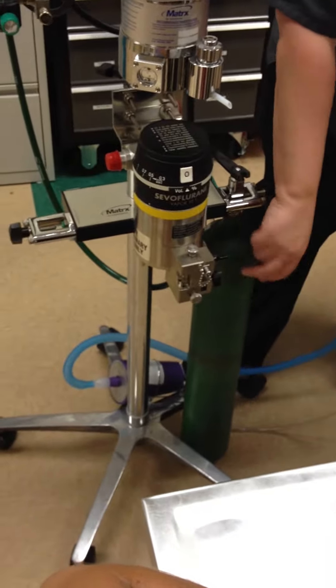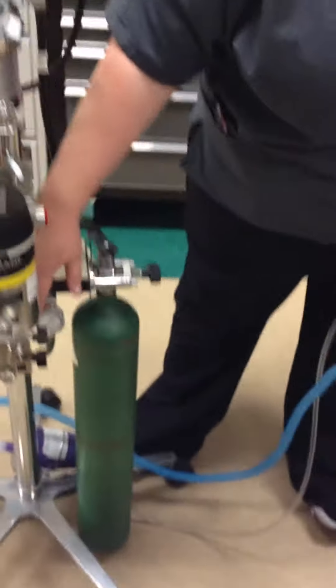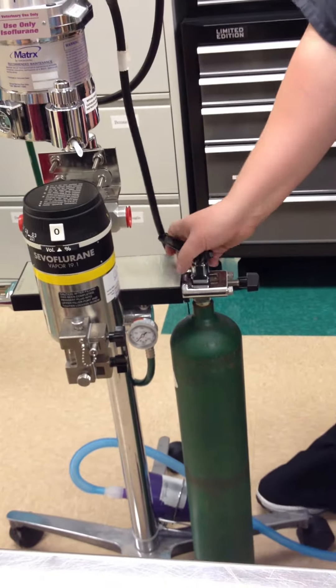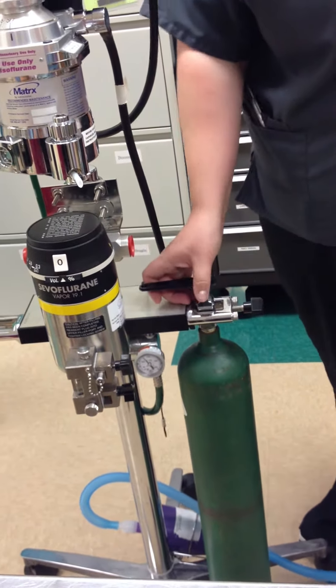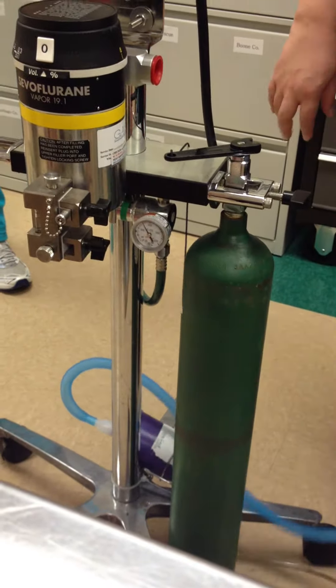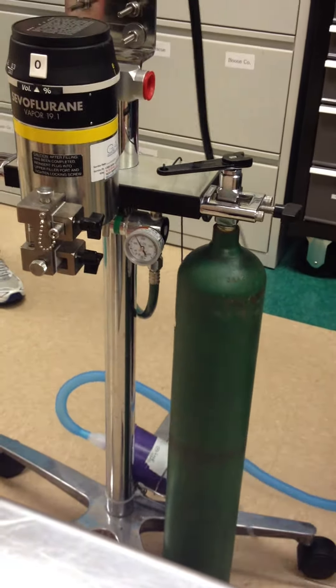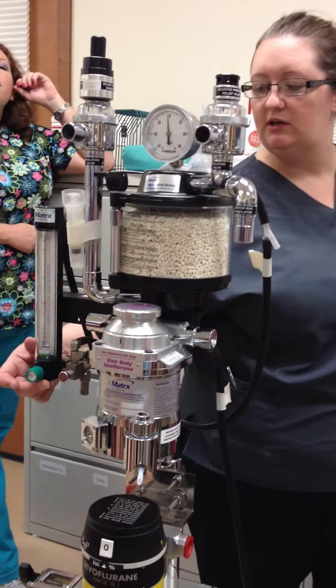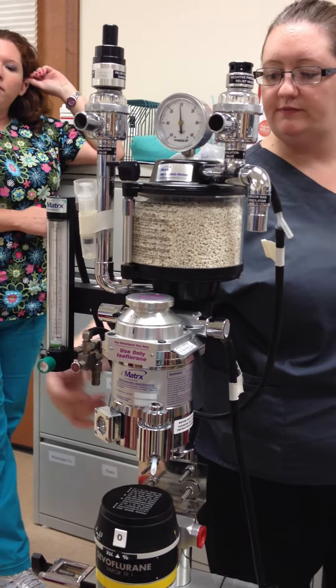So we got our oxygen tank. Pressure reducing valve with our gauge on it that tells how much oxygen we have in there. Righty-tighty-lefty-loosey. 1,500 PSI. So we've got 1,500 PSI, so we've got a lot of time left. It goes from our oxygen tubing to our flow meter. The flow meter is going to control how much oxygen is being delivered to our patient, and it's just a turn valve.